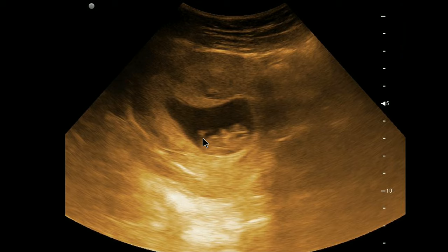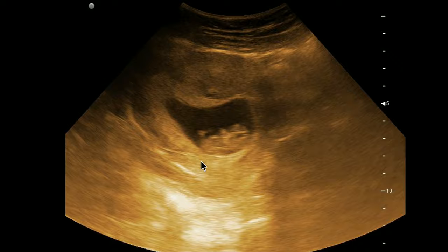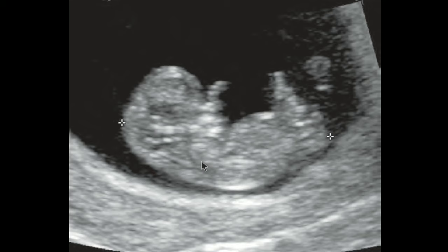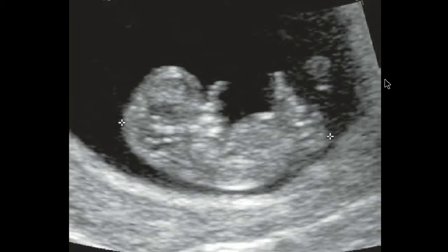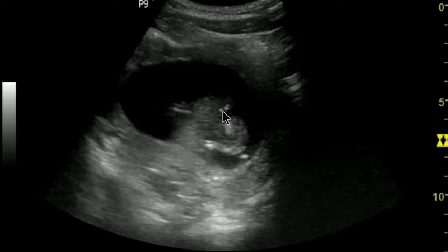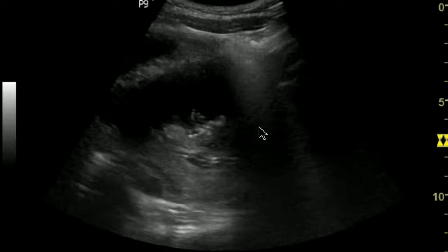Limb buds are seen as small projections from the body at around eight weeks. They elongate and gradually take the shape of limbs at eight to nine weeks of gestation. At around the tenth week, you can differentiate the parts of the limbs. You can also see the embryo's movement clearly at this age, and you can see fingers of the hand on the embryo.